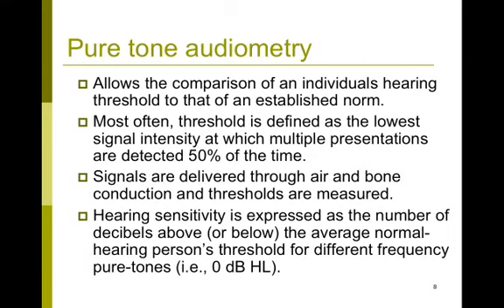Puretone audiometry is one of the earliest audiological test procedures, and it's still considered the gold standard for hearing assessment.